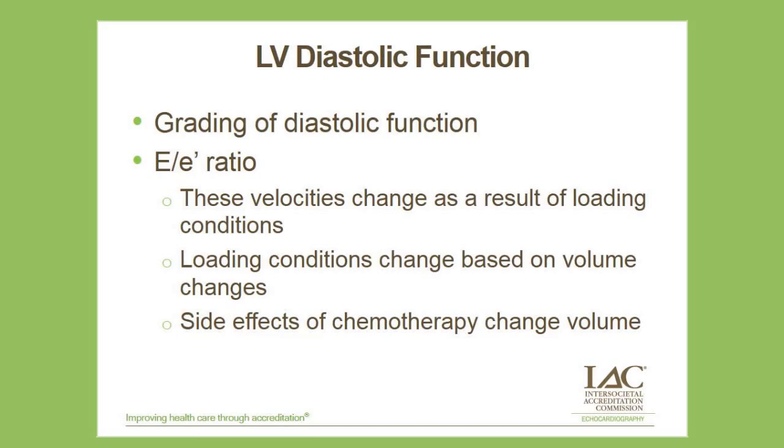And if we think about our chemotherapy patients, they have a lot of side effects. These people have nausea, they have vomiting, they have diarrhea, things that really change the volume. So we have to be careful when we look at that. And you may even want to go back and look at your left ventricular volume that you just traced and compare it to the last study to see what changes you have there.